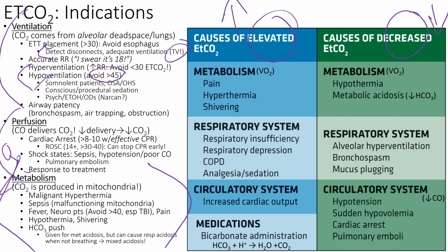But getting a trend is a way to know if we need to intervene, right? So you have an obstructive sleep apnea patient, and the CO2 sits at 45, and now it's like 55. It's like, oh, wake up. I'm going to put you on BiPAP, right? We can get an order for BiPAP and try this, right? We talked about conscious sedation, procedural sedation can cause hypoventilation.